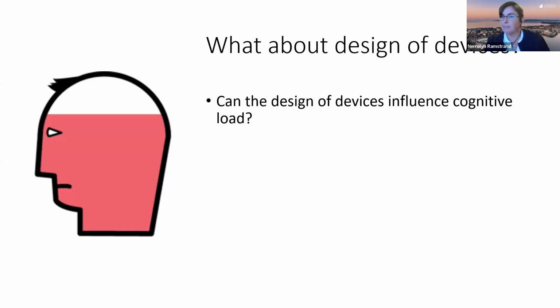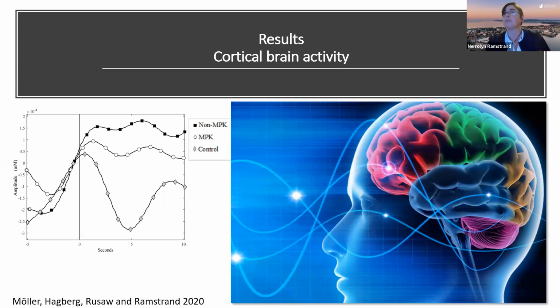We had one group that had microprocessor controlled knees, one group that had mechanical knees. And these two groups, we tried to have them as similar as possible. In the 6-minute walk test, there was no difference between these two groups, which is important to mention, as well as in the temporospatial data, there was no difference. But what you see here, and you can look from, this is the pre-test period from 0 until 10 is an average test period here.